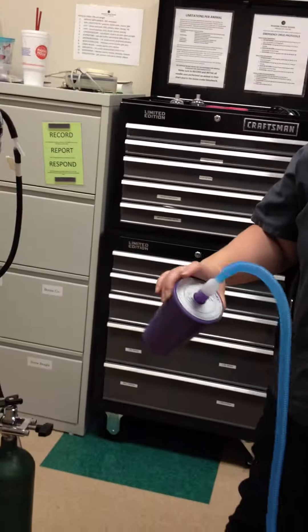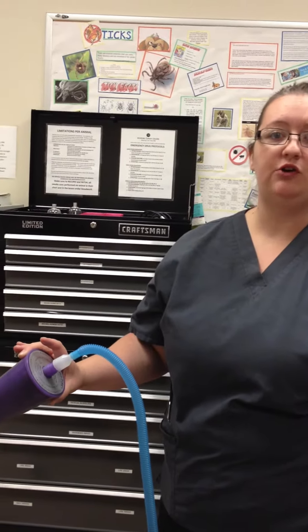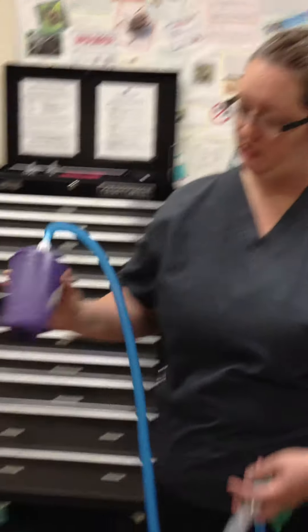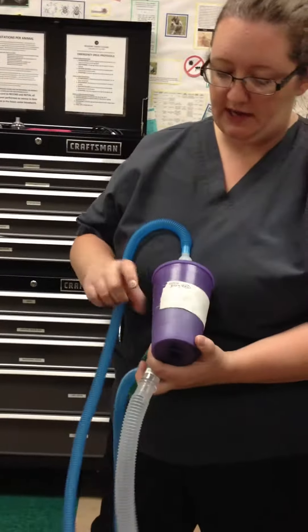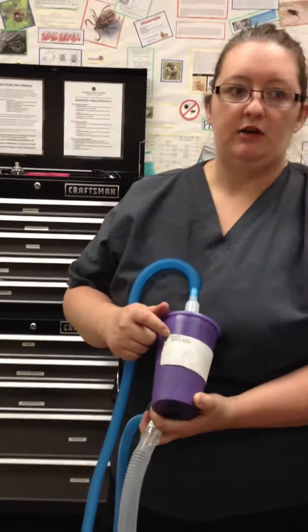And then we have scavenger tubing down to our charcoal canister. Our charcoal canister needs to be changed when it gains 100 to 120 grams from its original weight. There's a piece of tape on here that says what it was weighed at the first day it came in. So at the beginning and end of every day that we do surgery, you need to weigh the charcoal canister. All right, so now let's set up for a rebreather.